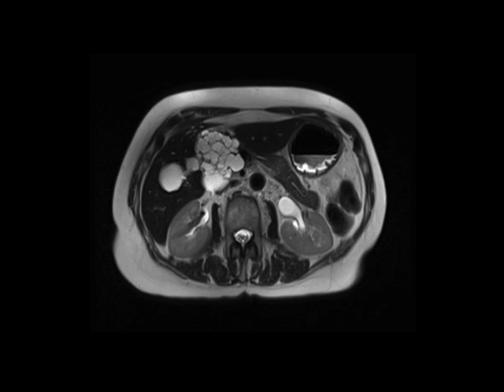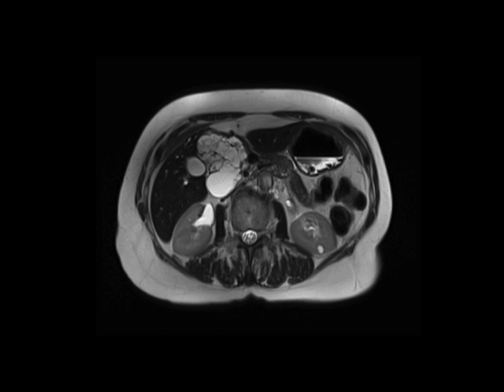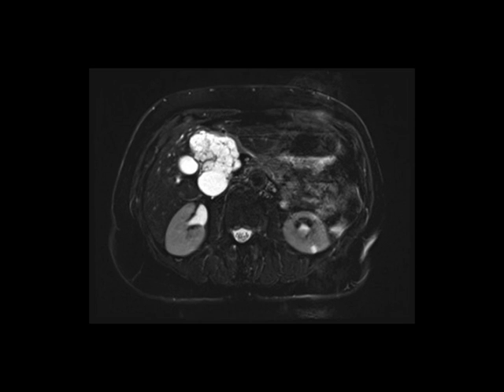Here's one of the most beautiful examples of this entity that I've seen in the last month or so. If you look at these MR images, first you see that there's a large mass centered on the pancreatic head. It's multicystic, multiloculated — the classic microcystic lesion. It has multiple small cysts, most of which measure under two centimeters in size, and they're really innumerable small cysts.